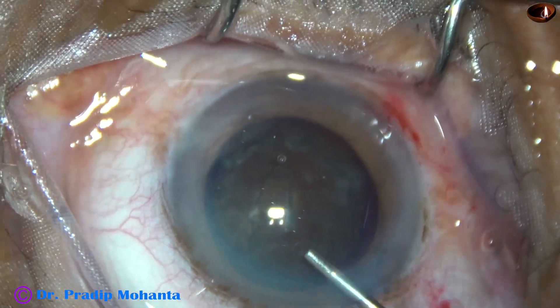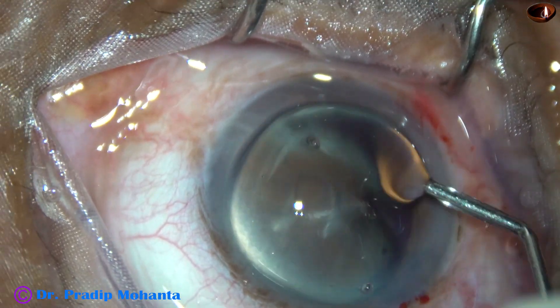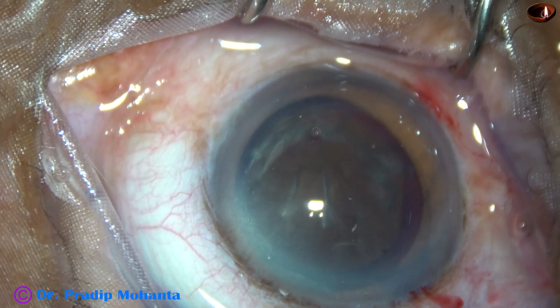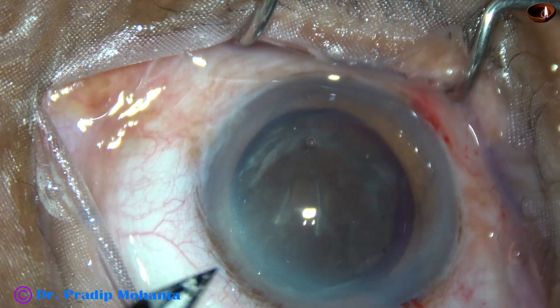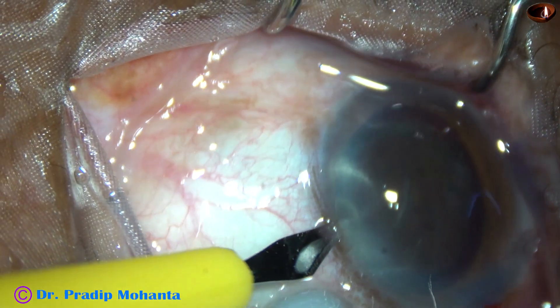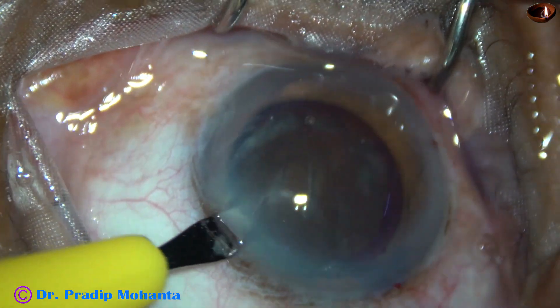The anterior chamber is filled up again with 2% HPMC. And now a side port is to be made on the left side of the main incision. This is the side port on the left side.